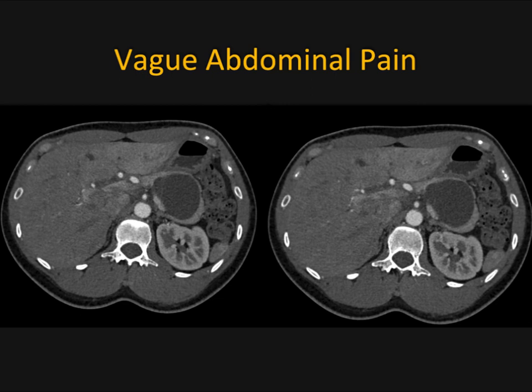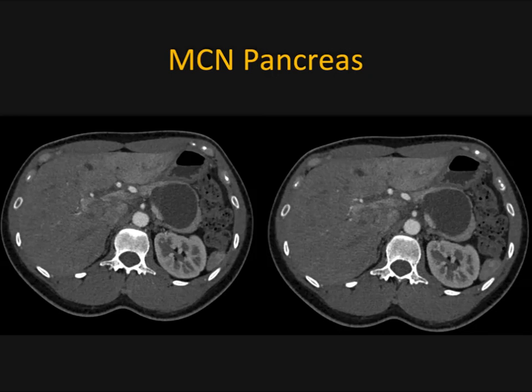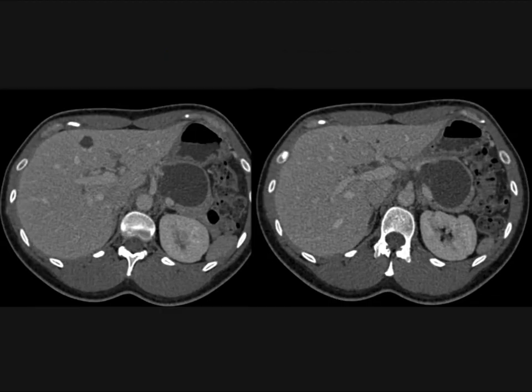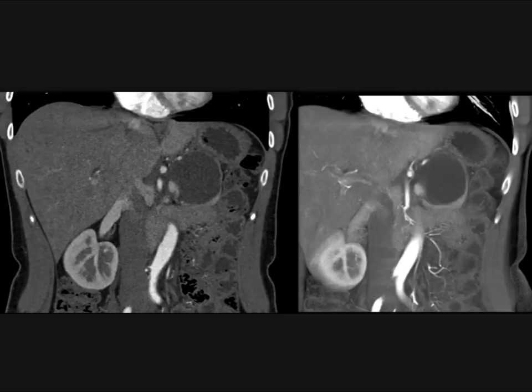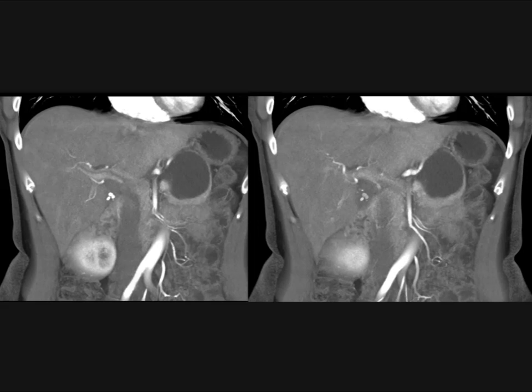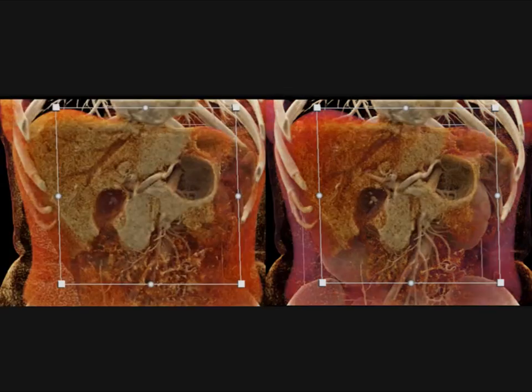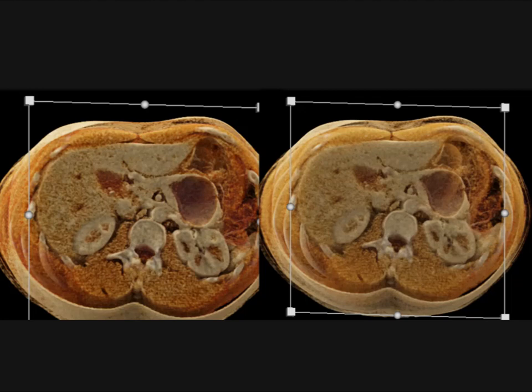Another example, almost the same as the case before: vague abdominal pain, well-defined cystic lesion at water density with a thin septation when you look hard, no dilated pancreatic duct — a very nice example of a classic mucinous cystic neoplasm. I'm giving you a lot of cases and coronal views so you really begin to understand how the lesion looks. With this appearance I simply describe a cystic lesion, its fluid characteristics, the septations, the wall and location, and then say this looks like an MCN. The cinematic rendering shows it very nicely, and the fluid density with the septation can be seen clearly.